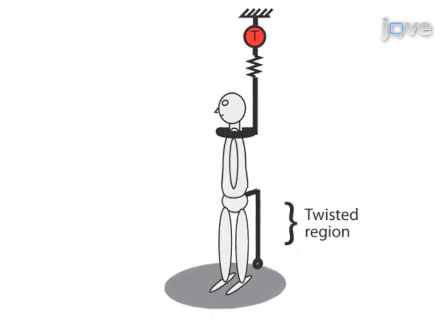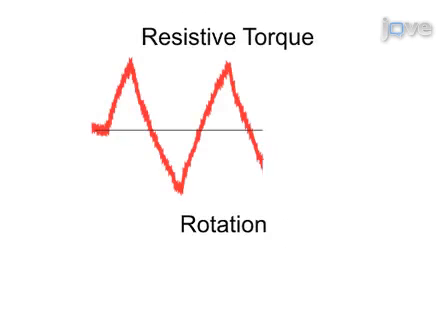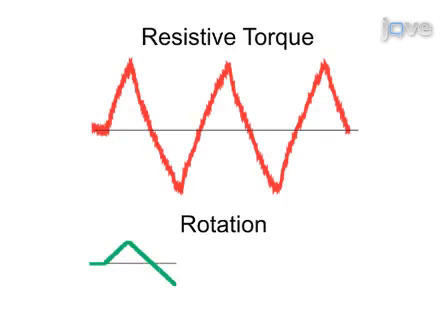As this device twists a selected region of the body axis, there are slow changes in the length of muscles crossing the region. Next, the resulting resistive torque is measured in order to quantify the tonic control of all muscles undergoing length changes.